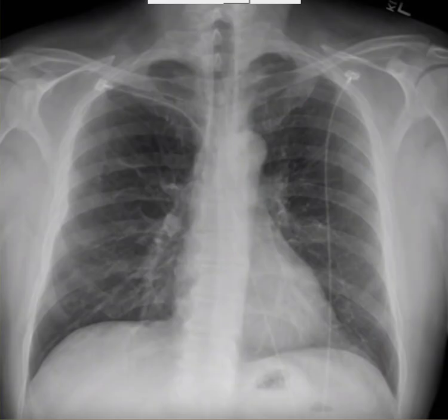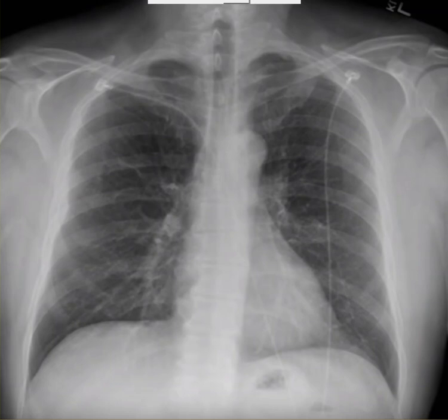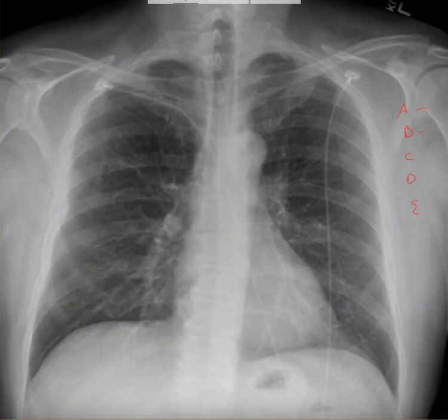That's pretty much it for the PA view anatomy. We'll do a separate podcast for the lateral view. Real quick before I stop, let's go over the basic reading system. Remember, it's A, B, C, D, E: A for airway, B for bones, C for cardiac silhouette, D for diaphragms, E for everything else.